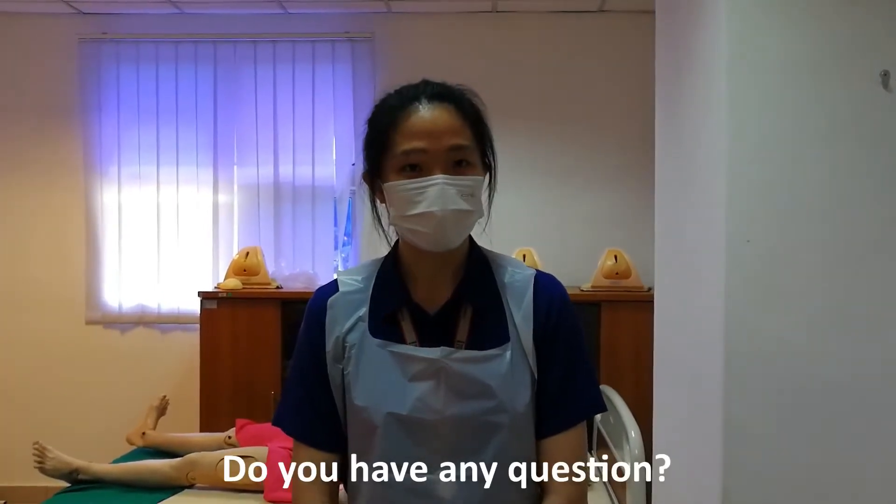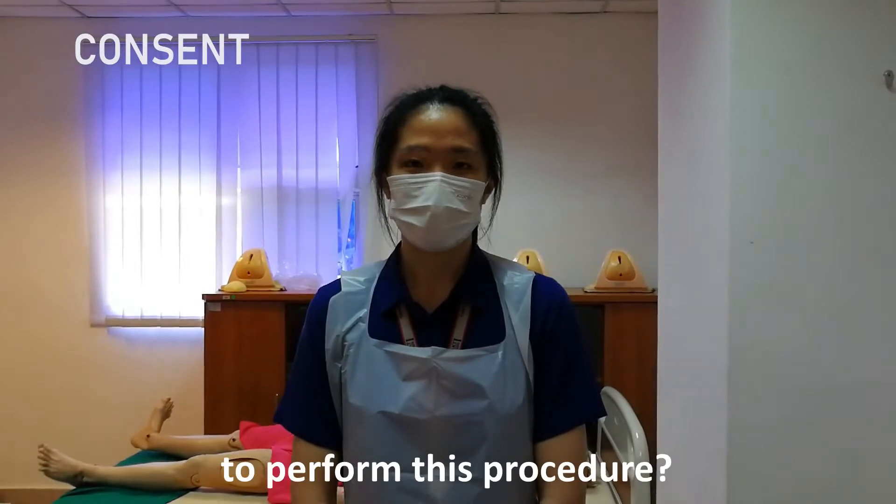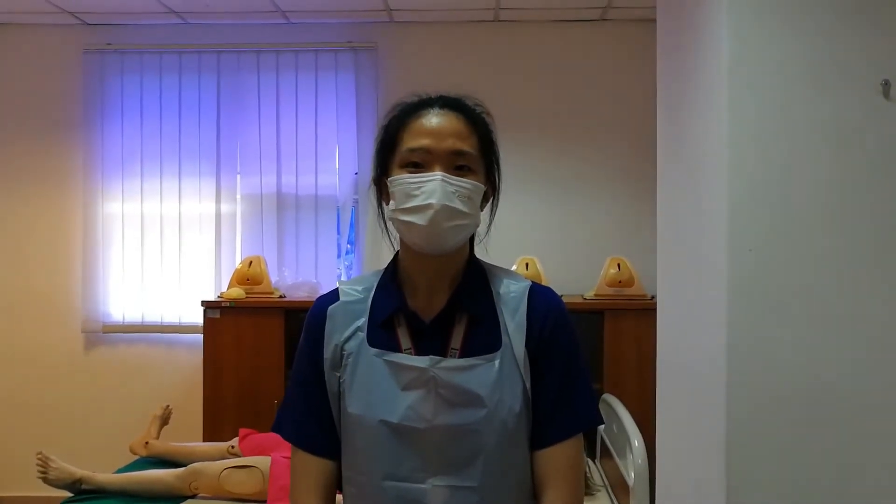Do you have any questions? Can I gain your consent to perform this procedure? Thank you.